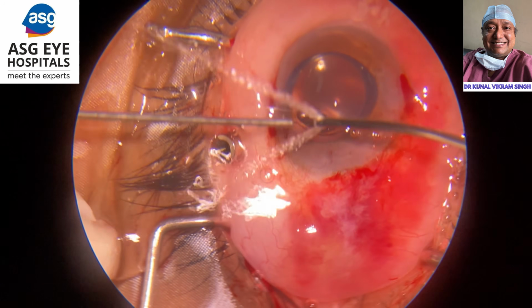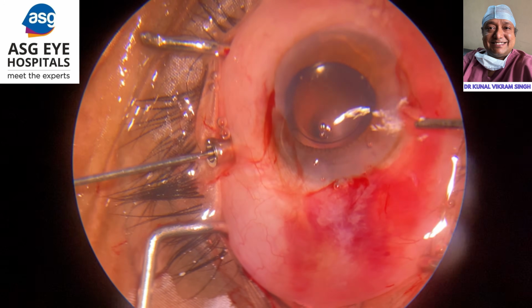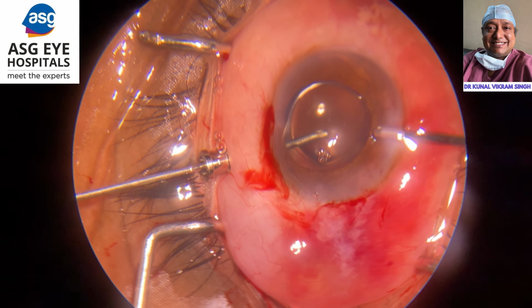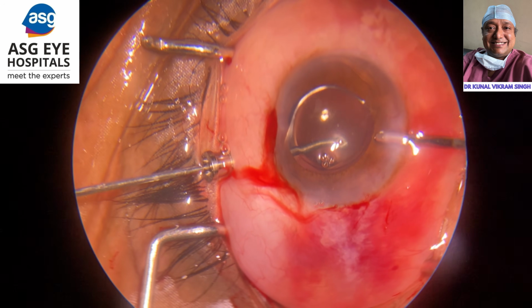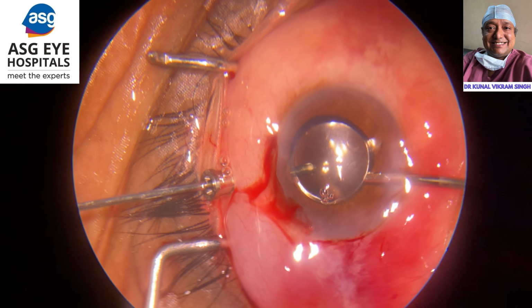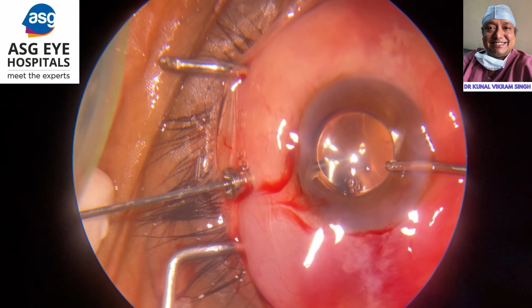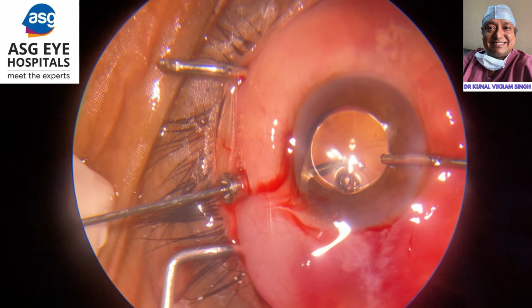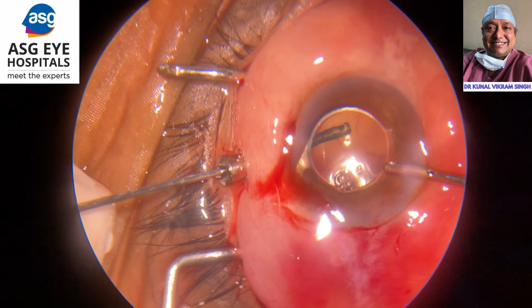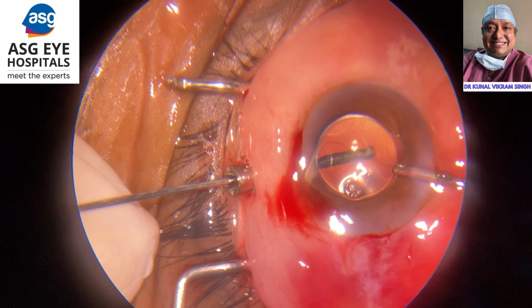Hypotony at times can cause suprachoroidal hemorrhage and further complication. So we have to be very clear that we don't go inside and do a blind dry vitrectomy. We must first introduce an irrigation cannula in the AC and make the IOP equal, and then we introduce the vitrectomy probe and do the anterior vitrectomy. Here, as soon as this particular maneuver was done, the AC was formed nicely. I became pretty okay. The IOP was normal, and from now onwards, the case was pretty much under control.